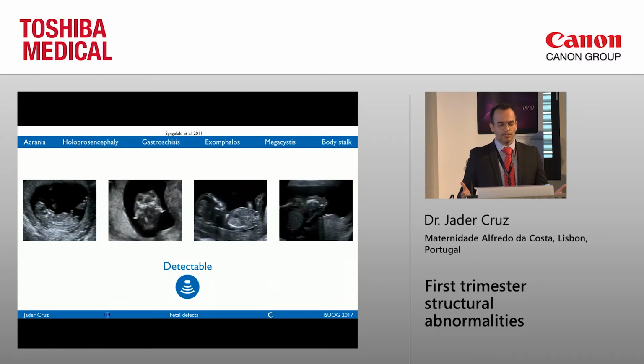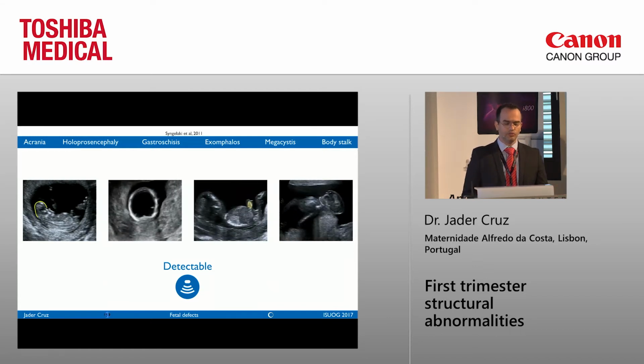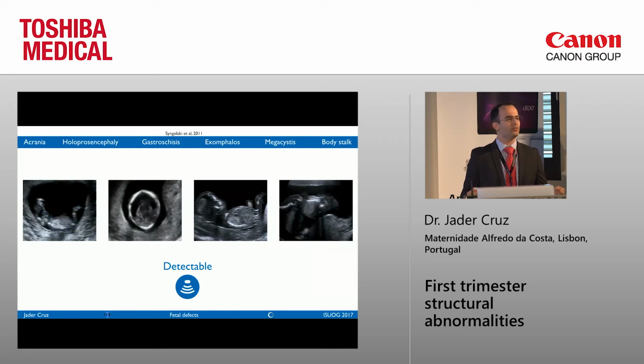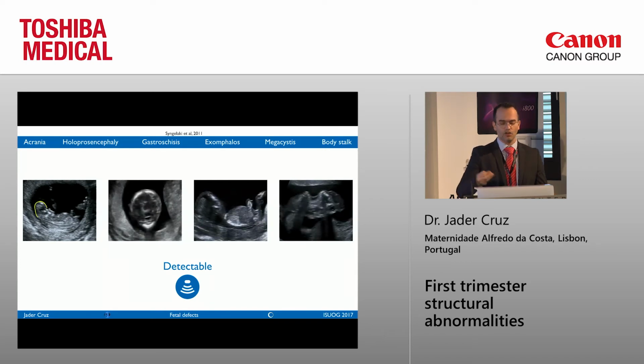These are the abnormalities that we always see in the first trimester. If you look at them, you will realize that you see them all the time because they are easily recognizable. We know already how to assess this kind of image.